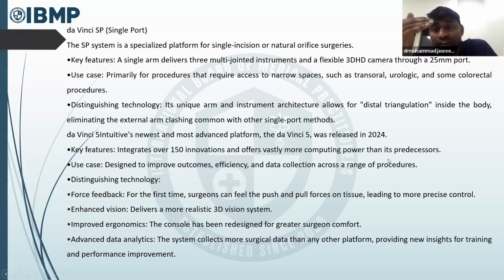Sure. So, when we are evolving from 2004 to 2024, it started with multiple ports, then was followed by single port. This is an evolution. So it's an advanced technology. From HD camera to 3D HD, depth perception has changed. Now you are using fluorescence technology. You can use single port. If you have any doubt, you can go for fluorescence technology to rule out any complication in the blood vascular system. And there are no clashes of multiple arms.